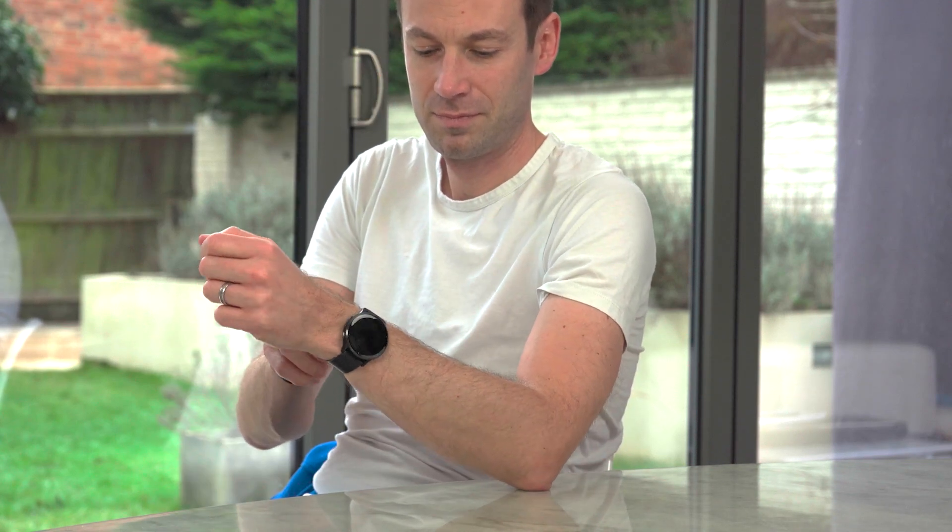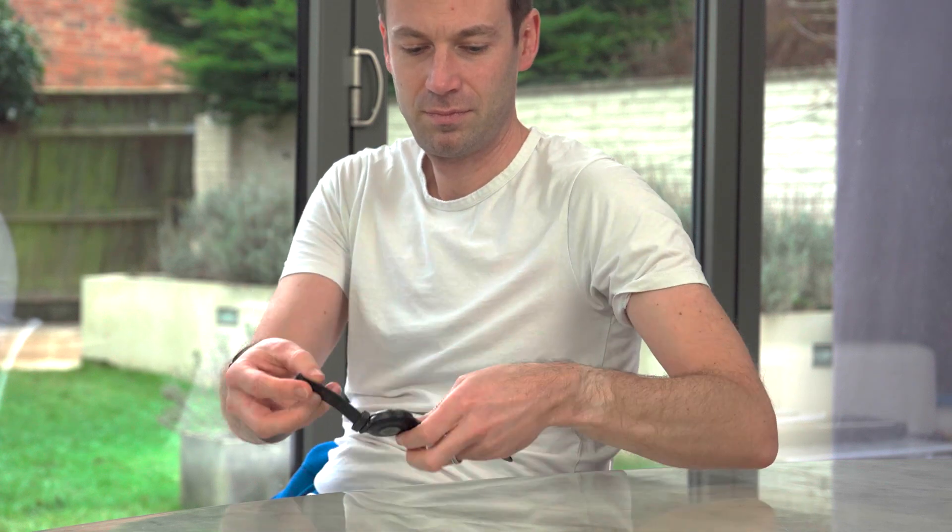Next, remove any items that could interfere with the blood flow in your wrist, like watches or bracelets.